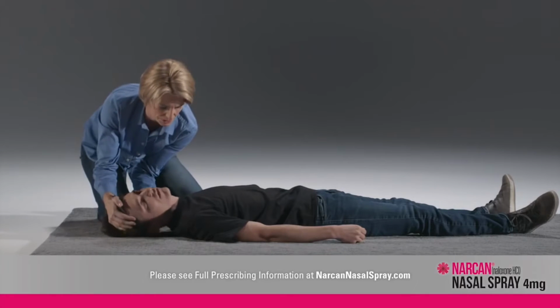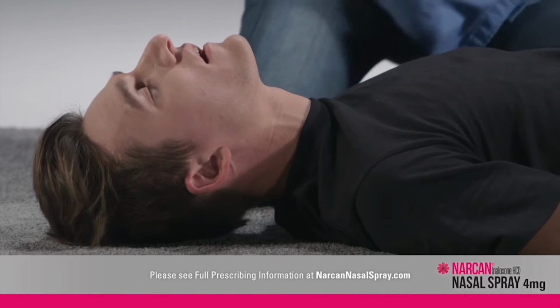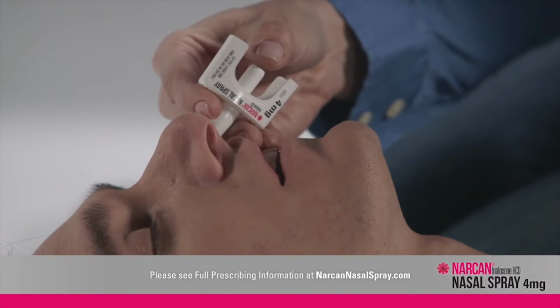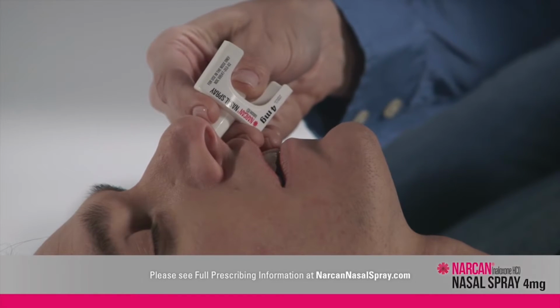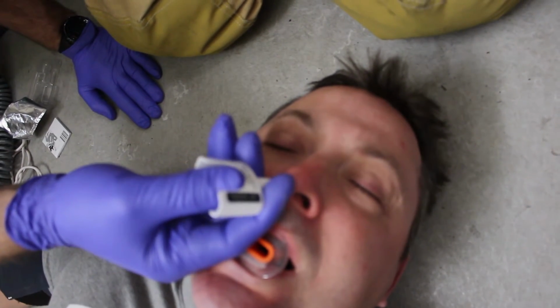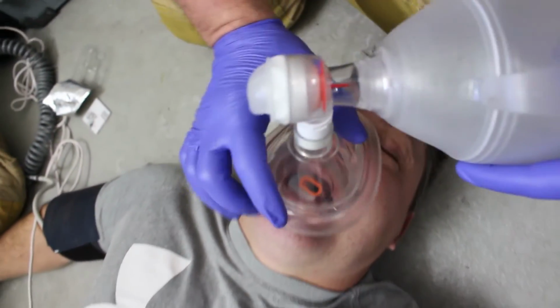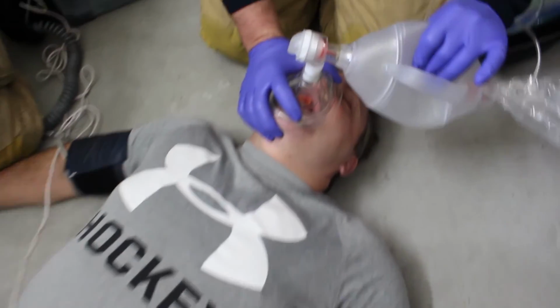Tilt the person's head back and provide support under the neck with your hand. Gently insert the tip of the nozzle into one nostril until your fingers on either side of the nozzle are against the person's nose. Press the plunger firmly to give the full dose of Narcan nasal spray. Remove the device from the nostril after giving the dose. Administer 4 milligrams intranasal using the naloxone. It may take 3 to 8 minutes for the naloxone to take effect.